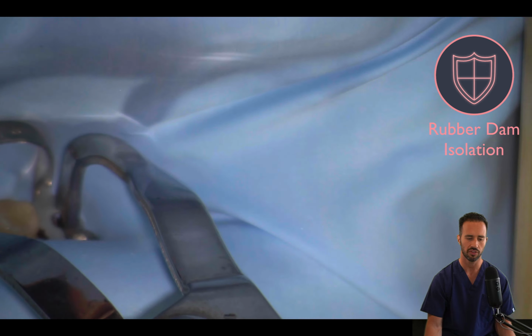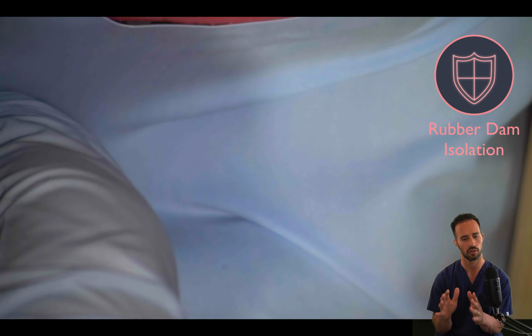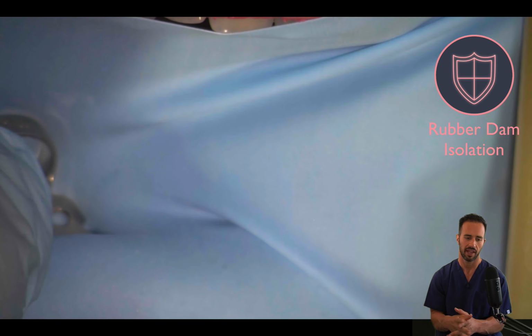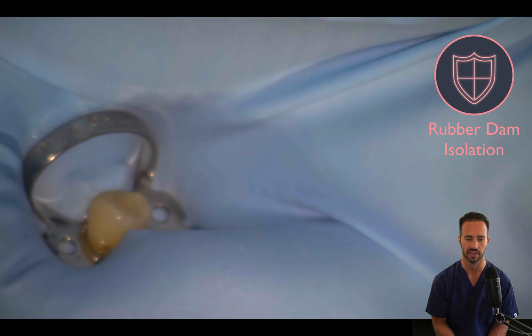So here we're placing the rubber dam on the tooth. This is a clamp number 2T on the premolar. That's our universal premolar clamp. And you can see I'm just removing the rubber dam off of the wings with my finger very easily.